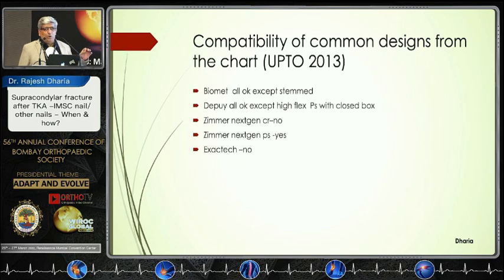Here the Biomet is all okay except the stem component. The DePuy is all okay except the high flex PS with the closed box. The Zimmer NexGen CR is no, the Zimmer NexGen PS is yes, and the Exactech is also no.